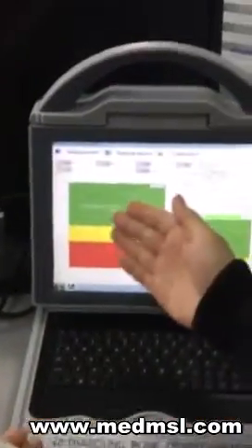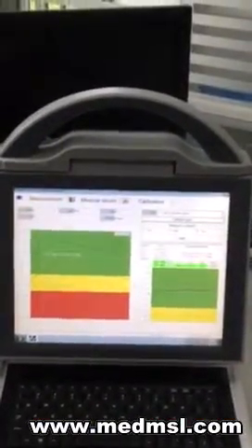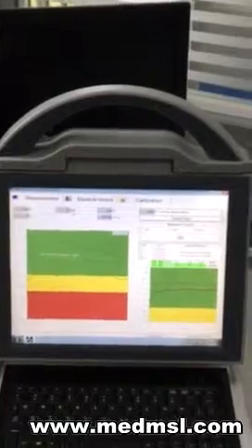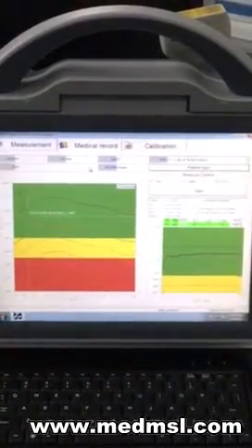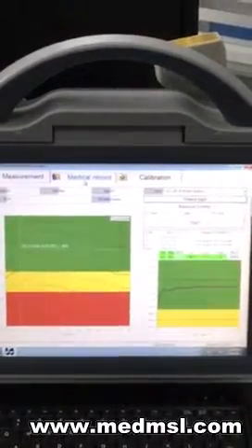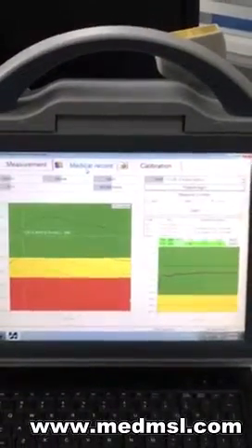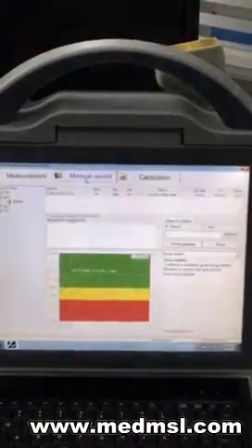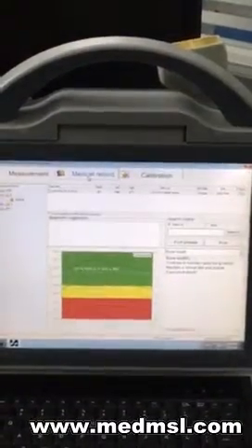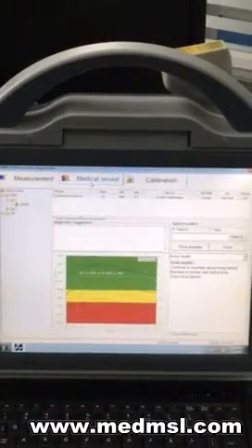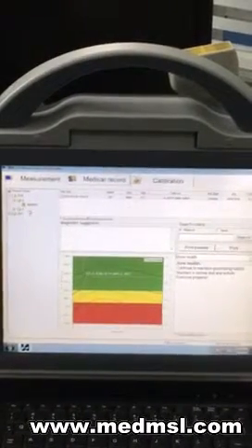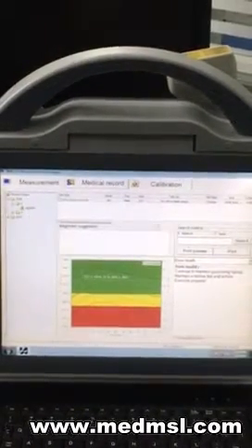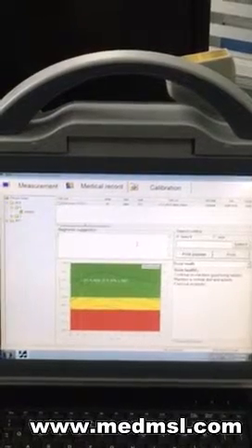Now the next step is the medical report record management. Click Medical Record. You will find the patient folder. You need to fill the diagnostic suggestion.